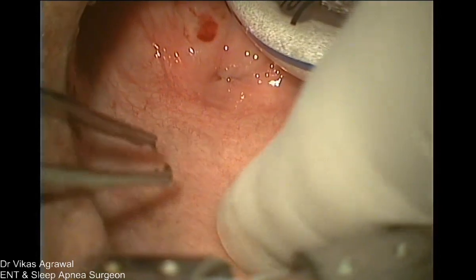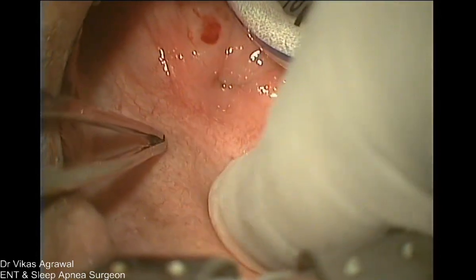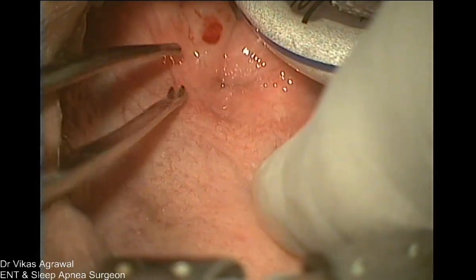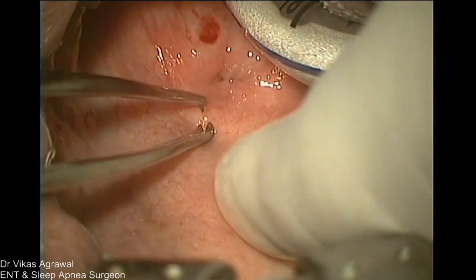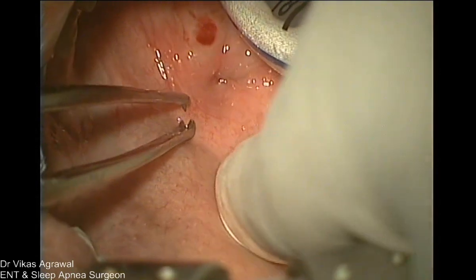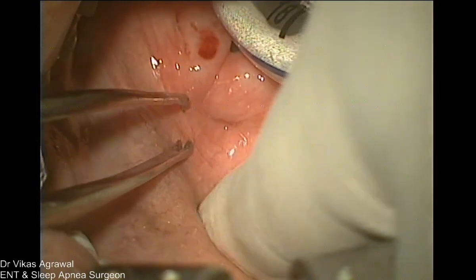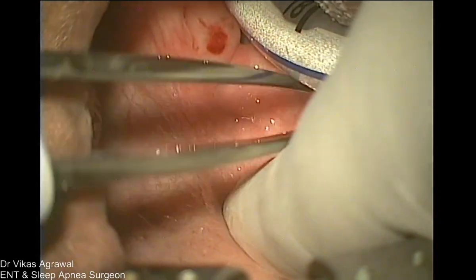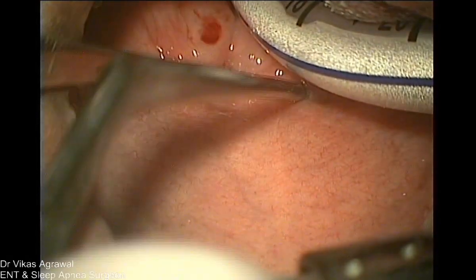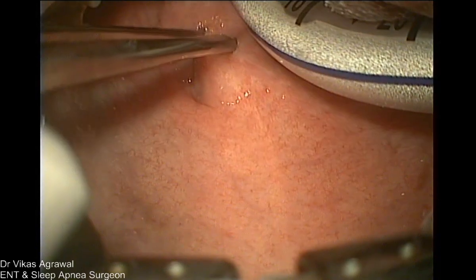Alright, so we'll continue with the surgery. As you understand, the line connecting the anterior pillar to anterior pillar is generally always half to 1 centimeter below the point which touches the posterior pharyngeal wall. So this is the line up to which you can remove or do anything to the soft palate.